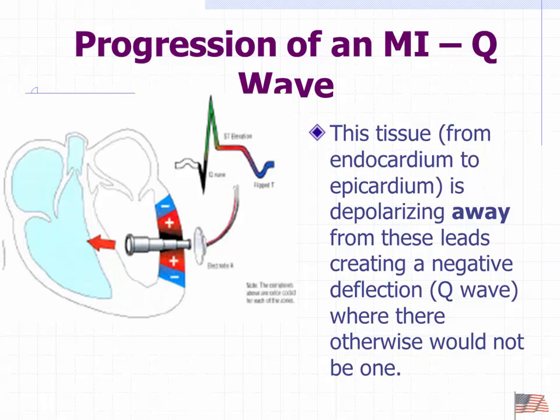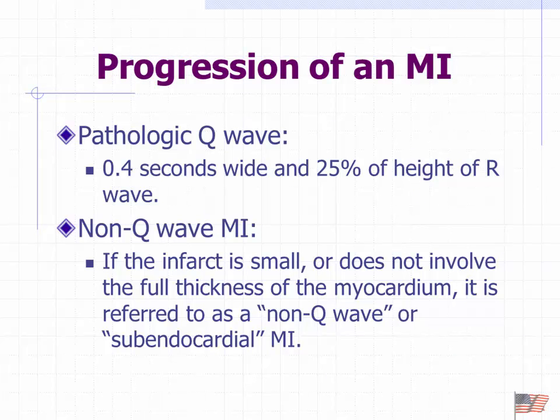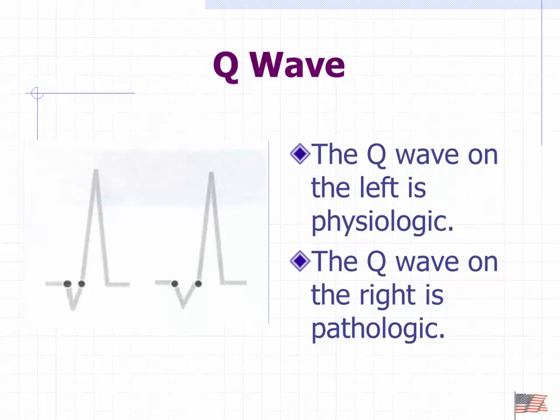The worst of them all, if you remember, let me go back a second. I think I've got a slide on it. I guess this is talking about the Q wave. You can see the significance. When I say prominent, it's not only the size, it's the width.